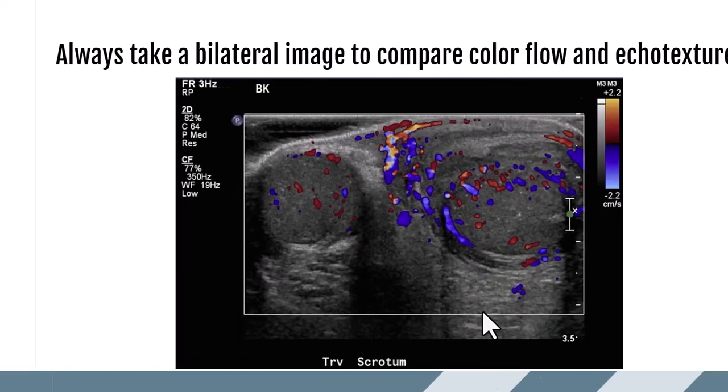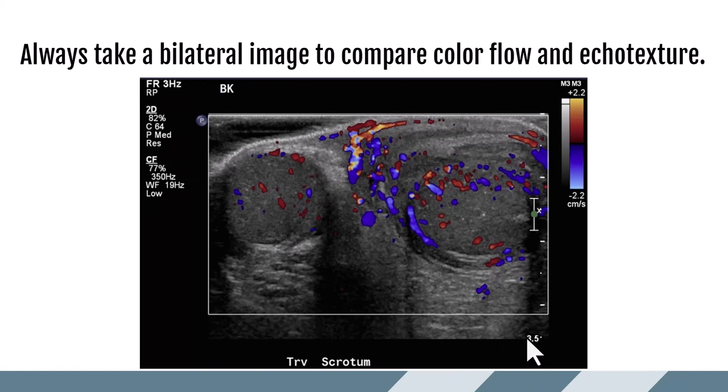We always want to get that bilateral image with color. A grayscale bilateral image allows us to compare echo texture, while a bilateral color image allows us to compare color flow. Just looking at these two images, we can see the left scrotum is hyperemic with increased blood flow compared to the right, and echo texture-wise there is much thicker scrotal skin on the left. If this patient was presenting with pain, this one picture tells us they are not suffering from torsion and are most likely suffering from some sort of infection of the left testicle, given the scrotal wall thickening and increased vascularity.